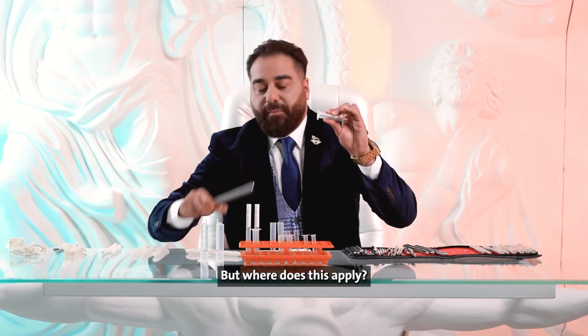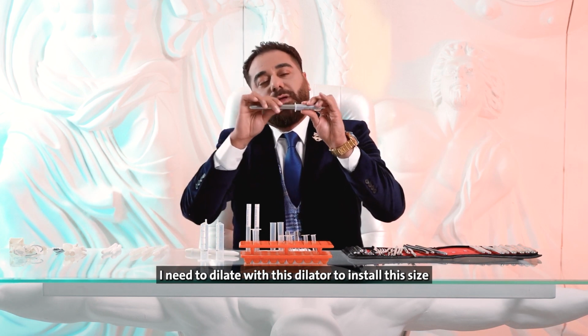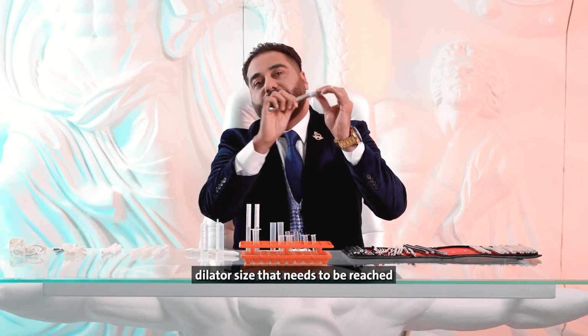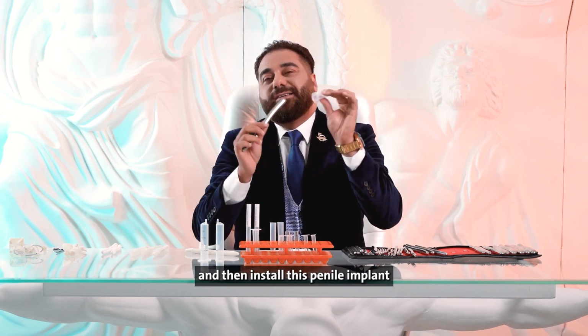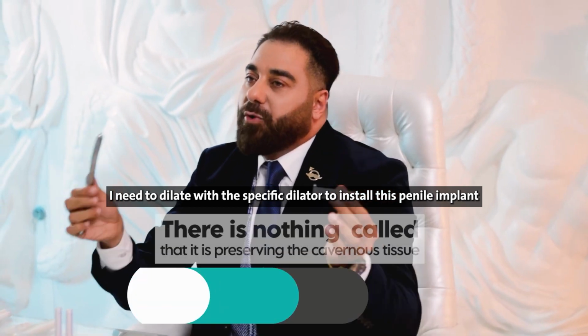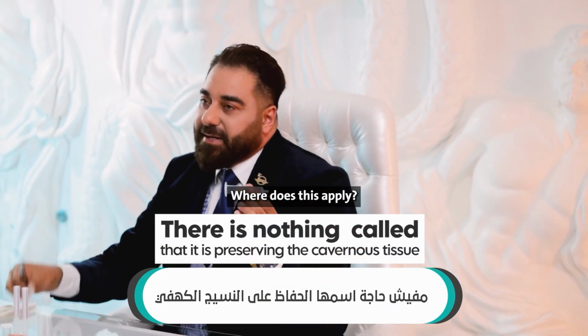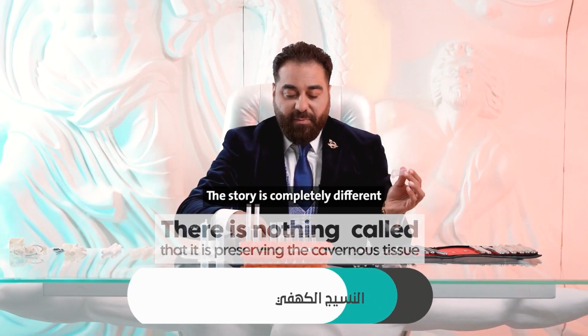But where does this apply? With the flexible penile implant, I need to dilate with this dilator to install this size. Each penile implant has its corresponding dilator size that needs to be reached. I can't dilate with this dilator and then install this penile implant. I need to dilate with the specific dilator to install this penile implant. Where does this apply? With the flexible penile implant, not with the hydraulic penile implant. The story is completely different.